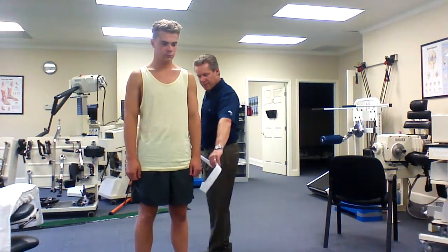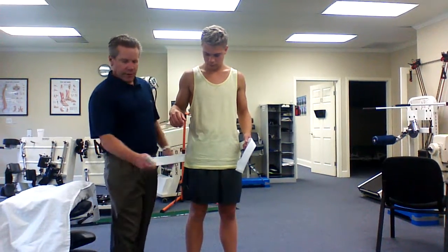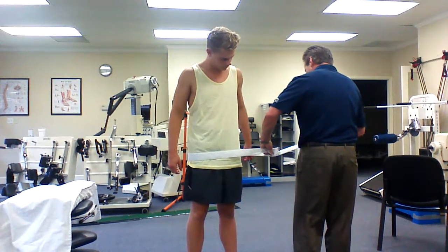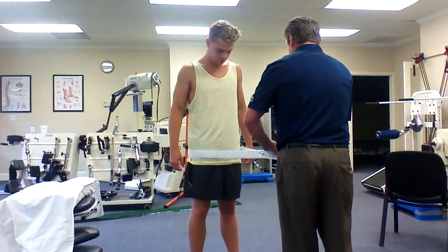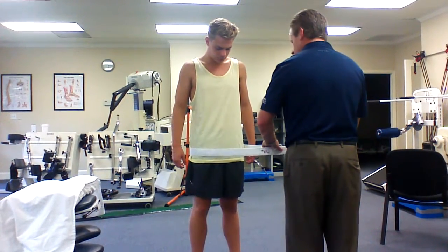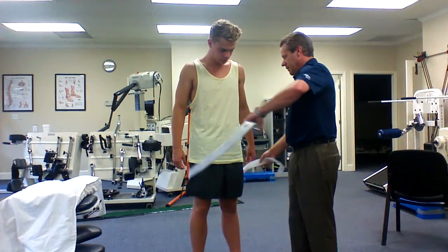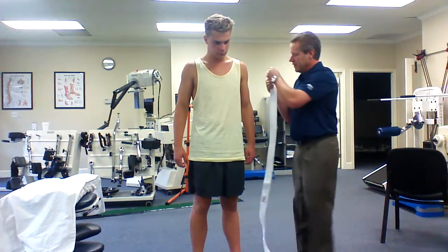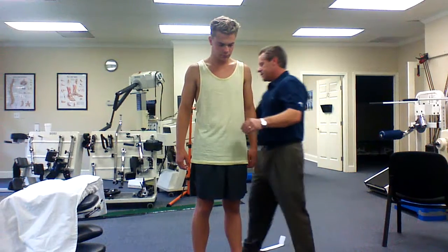Luke, I'm going to have you hold that right there, and then I'm going to wrap this around your waist. This is going to go a lot lower than what you would probably expect it to go. I have two of them here, but it allows me to stay a comfortable distance. You know what — I put that around backwards. You want the grippy stuff to be against them.